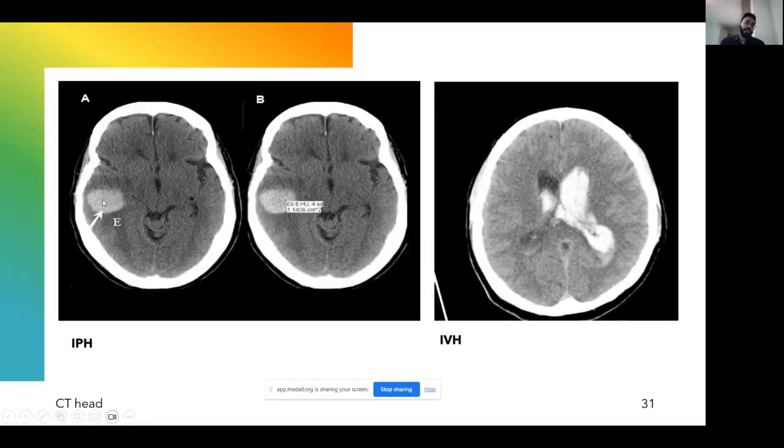In this case, the bleeding is within the parenchyma. And how do we differentiate between soft tissues and bleeding? Obviously, we have your Hounsfield unit. So you place a small circle there, and the computer is showing you that it is about 68.6 Hounsfield units, which is quite high for tissue. So this can be blood. So this is intraparenchymal hemorrhage. And in this case, there is bleeding into the ventricles as such. So there's an intraventricular hemorrhage.